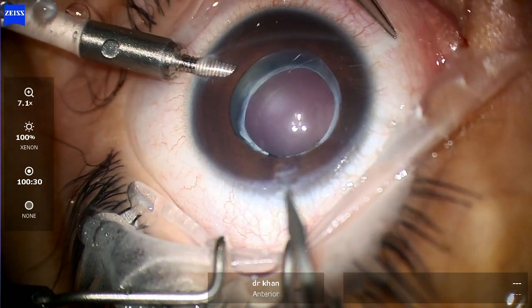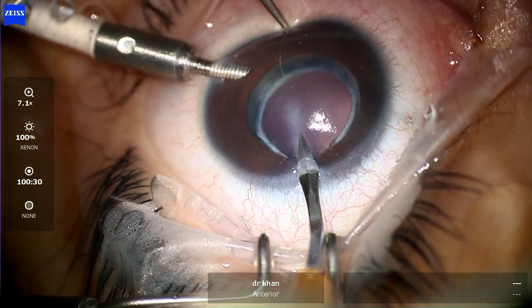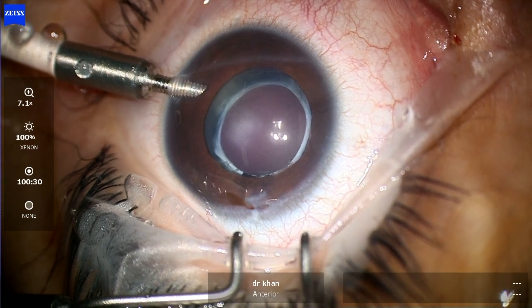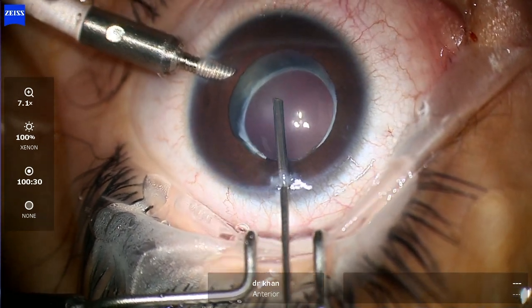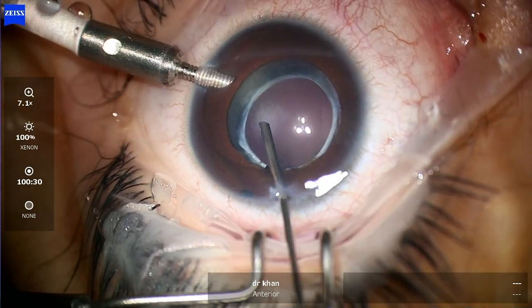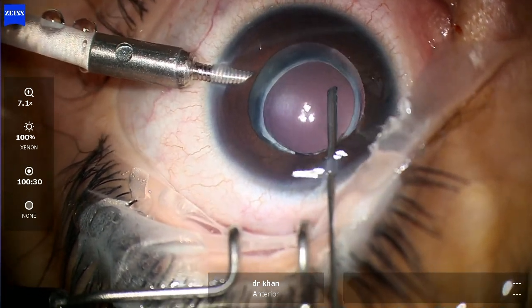After the insertion, you can see the insertion of the AC maintainer and the second wound for the vitreous cutter. You can use the same wounds just to avoid more scarring — scars are already there, so you can use the same wounds, they open quite nicely. This is the anterior vitrectomy; you want to make sure that there is no vitreous in the anterior chamber. The cut rate is 10,000 and the vacuum is at 600.